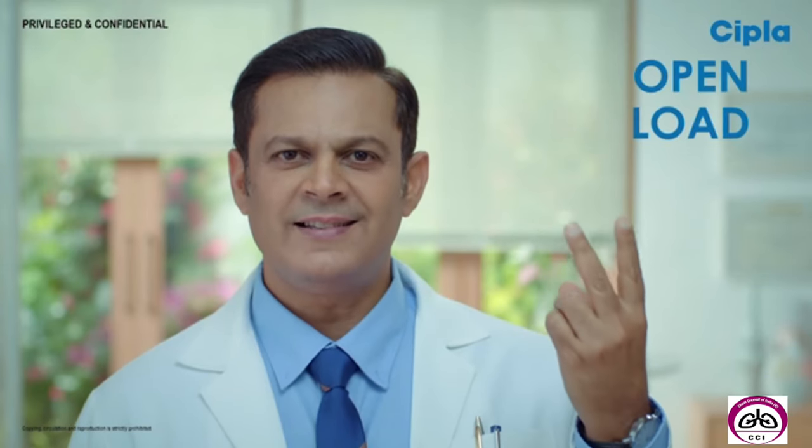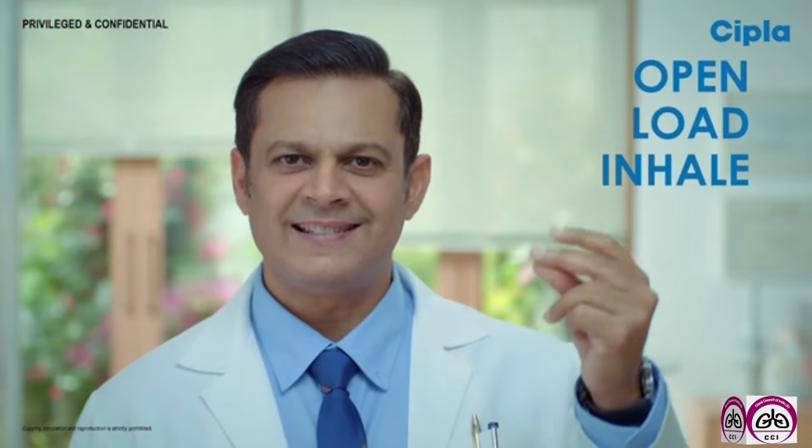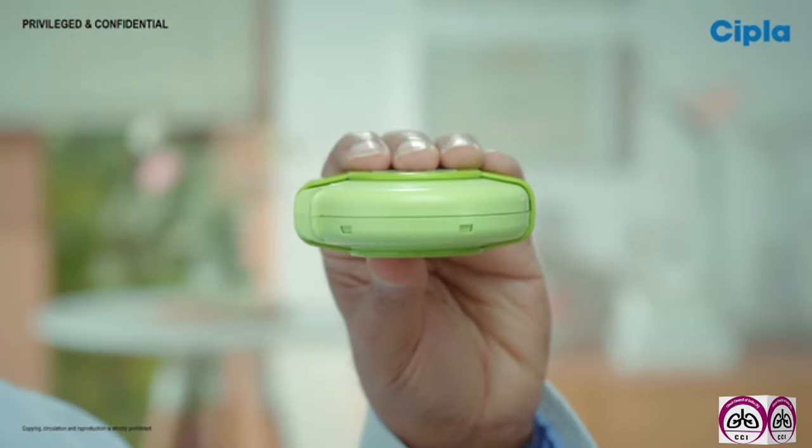To take your dose, follow three simple steps. Open, load, inhale, and you're done. The snap. Hold the SipHaler in one hand like this. Always make sure that the SipHaler is in a horizontal position. Place the thumb of your other hand on this thumb grip.